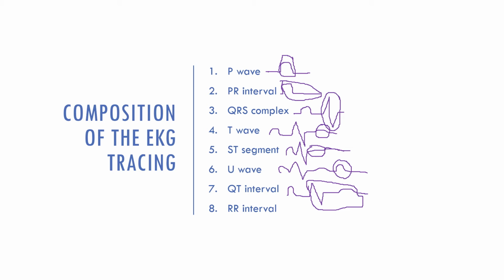You have your P wave, QRS, slight T, then you have another P, QRS, to a slight T. And they're looking at one QRS complex to the end of another QRS complex. That is what that one is looking like.